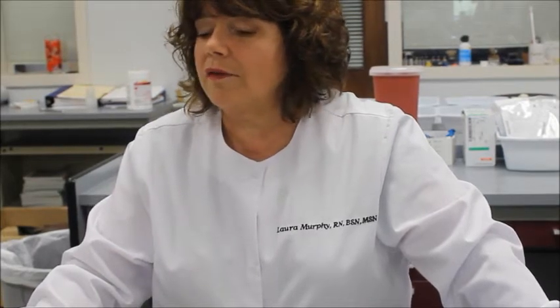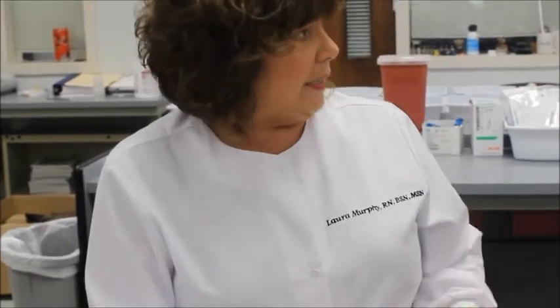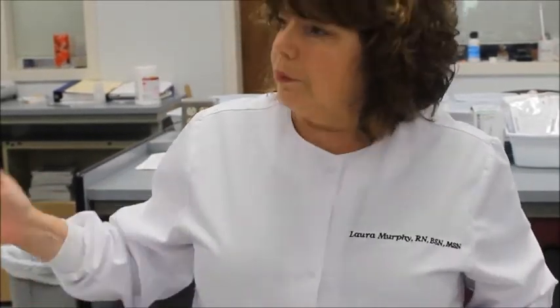Class, today we are going to demonstrate what y'all have learned in class. We're going to demonstrate the IV initiation process, and that's going to involve starting an IV. We're going to prime the fluids. We're going to work the pump. We're going to convert from the IV fluids to an INT so that they can go down to X-ray. We're going to reconnect, program the pump, and DC.